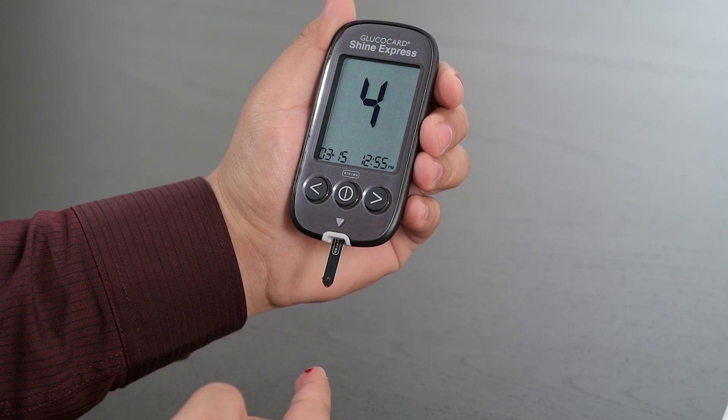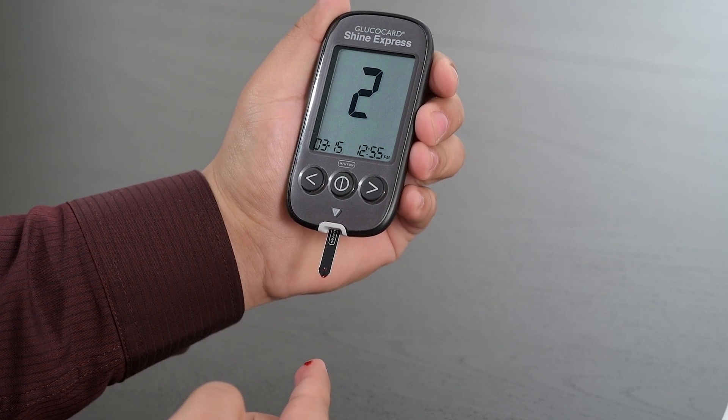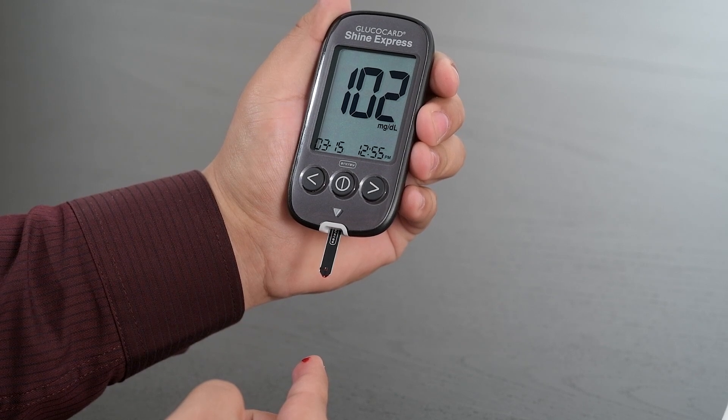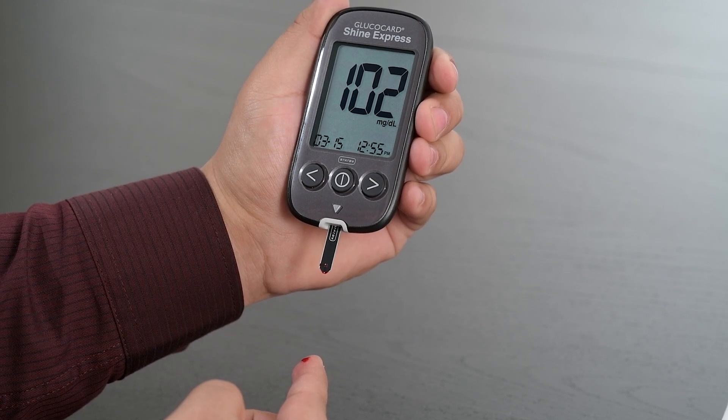Once the meter has finished counting down, your blood glucose result will appear and the meter will also announce this result. Your test is now complete.